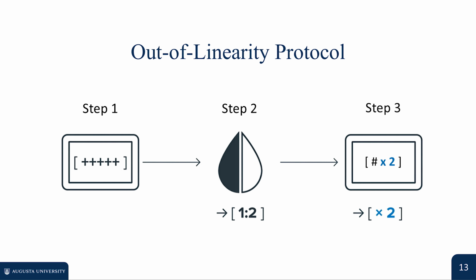When a patient's cell count exceeds the instrument's operational linearity, the analyzer displays the +++++ flag. The laboratory scientist must execute a manual dilution protocol using isotonic diluent. The first step is to recognize the overrange flag. In step 2, the laboratory scientist pipettes 500 microliters of well-mixed whole blood and mixes it with 500 microliters of diluent to prepare a precise 1:2 dilution.